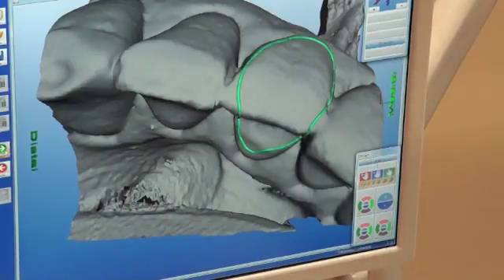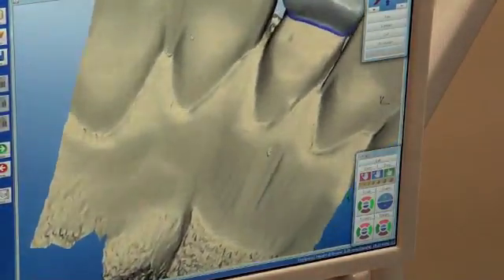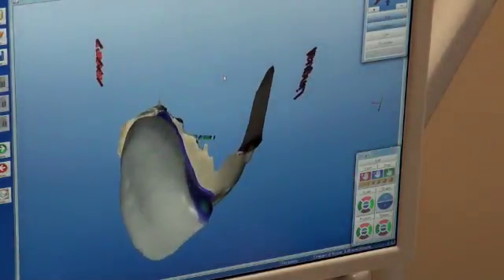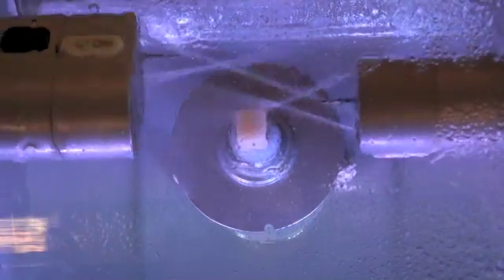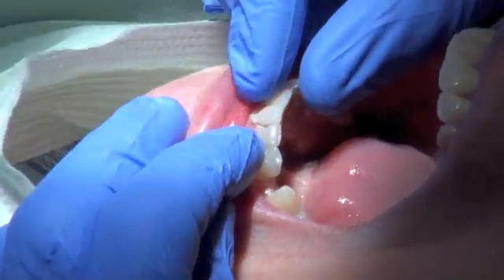The before rough draft image is then pulled up in the program and superimposed over the final preparation of the tooth. A virtual rough draft of the veneer is then created. Slight adjustments to the virtual veneer are made, and then the virtual veneer data is sent to a robotic milling unit which carves the veneer out of a block of solid porcelain chosen specifically to closely match the patient's other teeth.